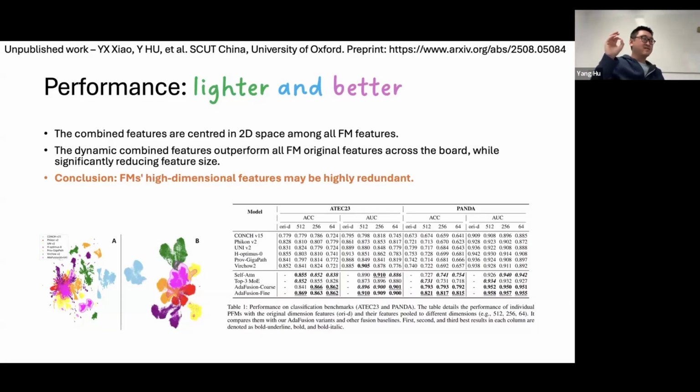So we decided not to do that further. Do we need a more aggressive reduction of the feature size, to 8 or 4? I think we tried 32 and 16. Not good. So we decided to stop it.